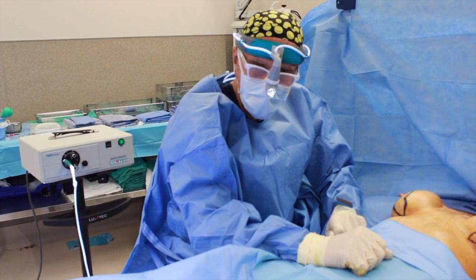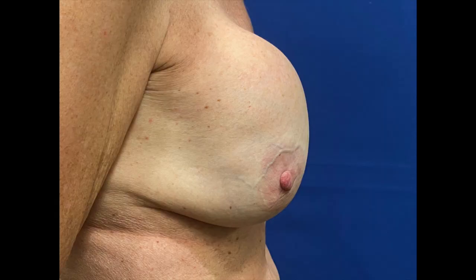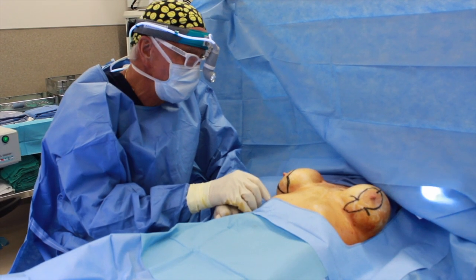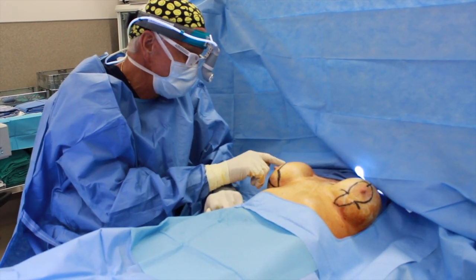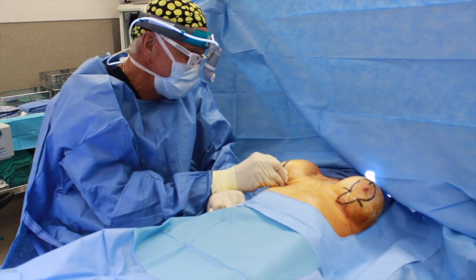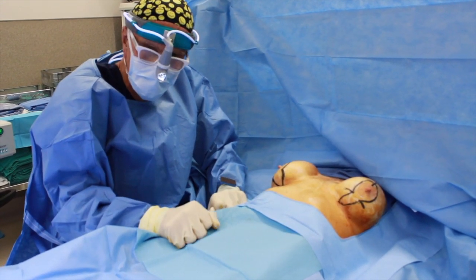Today we are removing some 30-year-old breast implants and, as you can see, they're extremely encapsulated — they're rock hard, the breast is distorted. We're going to raise the nipples a little bit; they were drooping. We're going to raise the nipples up, tighten up the breast envelope, and get rid of all of this scar tissue and this 30-year-old implant.